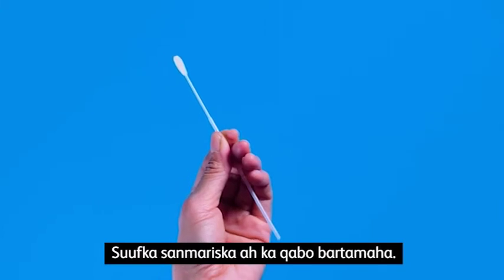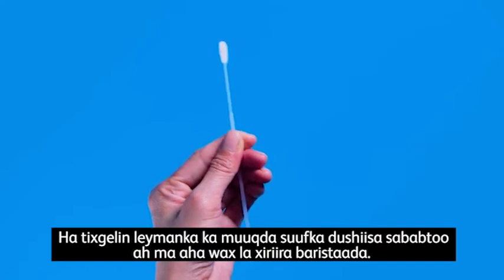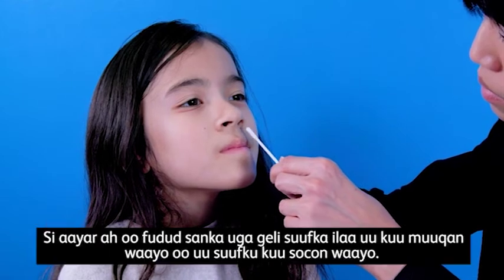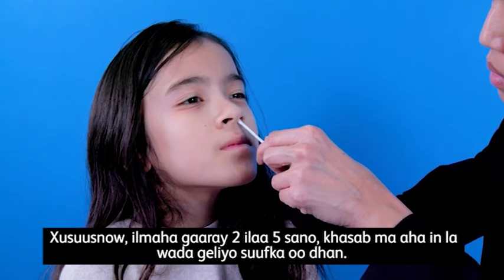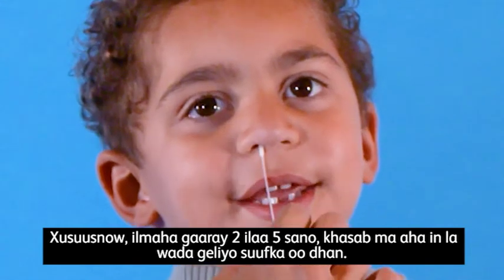Hold the swab at the midpoint. Please ignore any lines or markings that may be on your swab, as they are not related to this test. Hold the child so that their head is still. Slowly and gently insert the swab until the swab head is no longer visible and you meet resistance. For children 2 to 5 years old, it is not necessary to insert the full swab head.